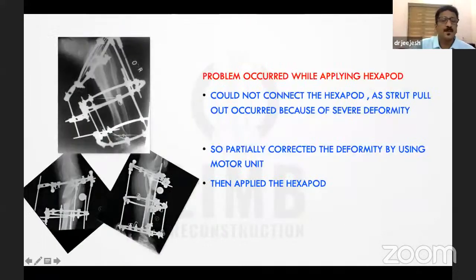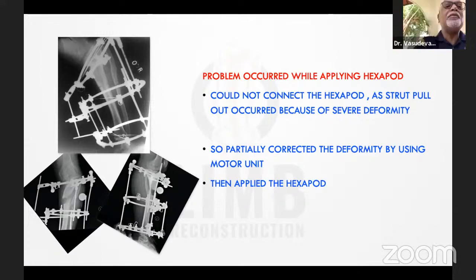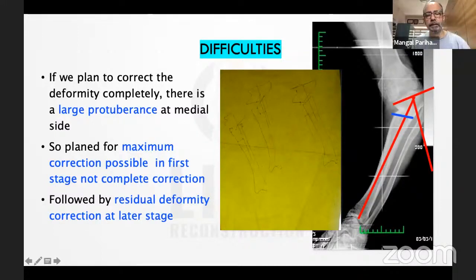Yeah. Here you can see the osteotomy was transverse. Instead of that, we tend to use an osteotomy like this. Just imagine the osteotomy is higher on the medial side and lower distally. Then that won't produce that much of a spike on our subcutaneous skin. Yeah, this was the planning. What he's saying is something like this, reverse, in this direction, so that the medial edge is not as prominent.